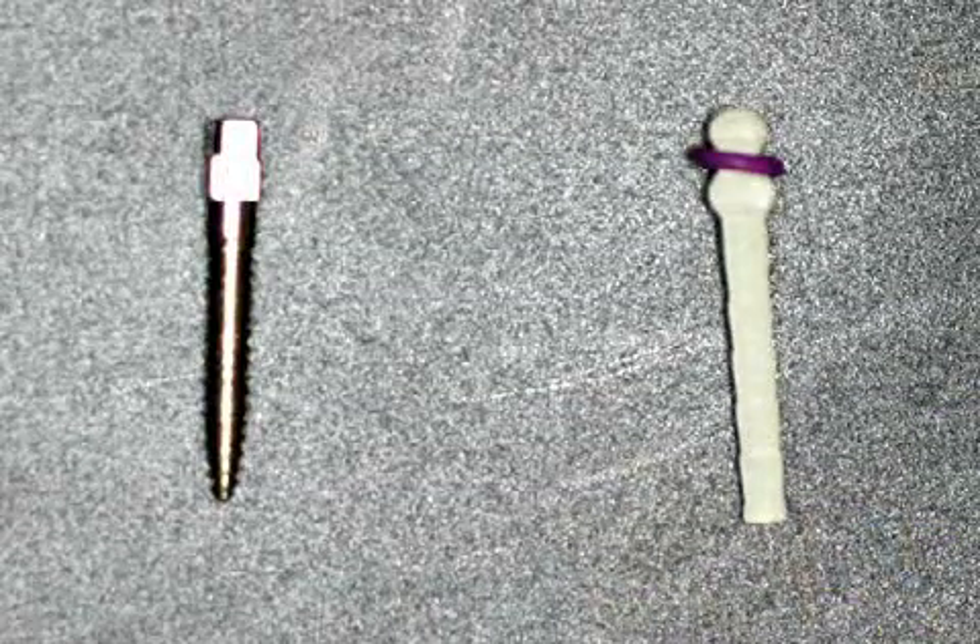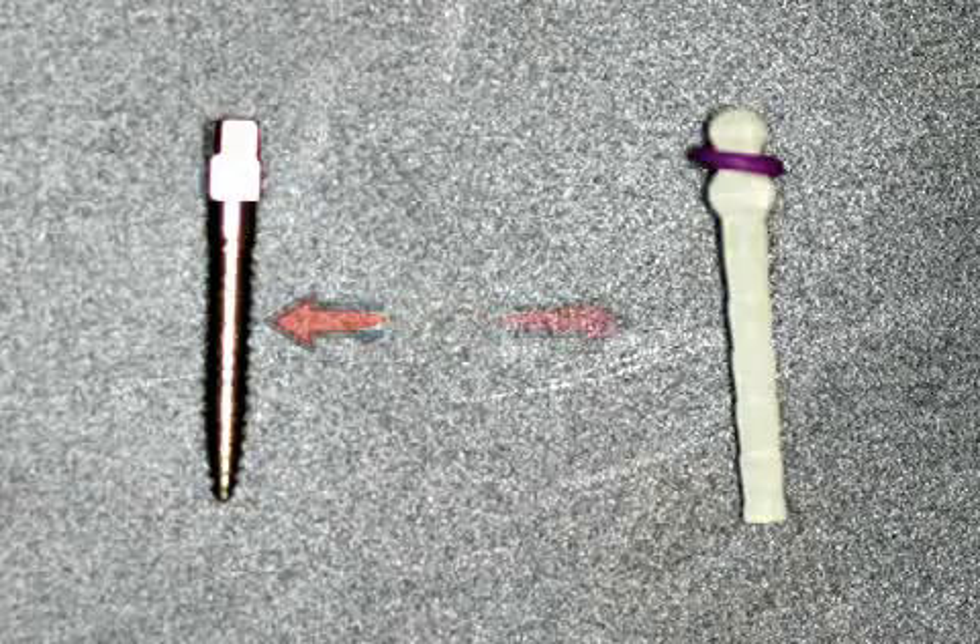Custom-made pivots are no longer that common, except for root pivot caps. Here you can see various prefabricated root canal pivots: on the left, a prefabricated steel pivot, and on the right, a prefabricated fiberglass pivot.